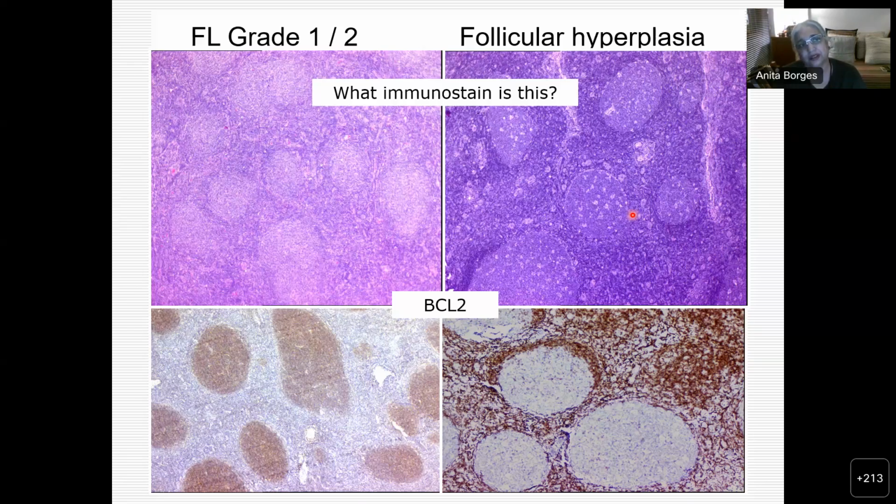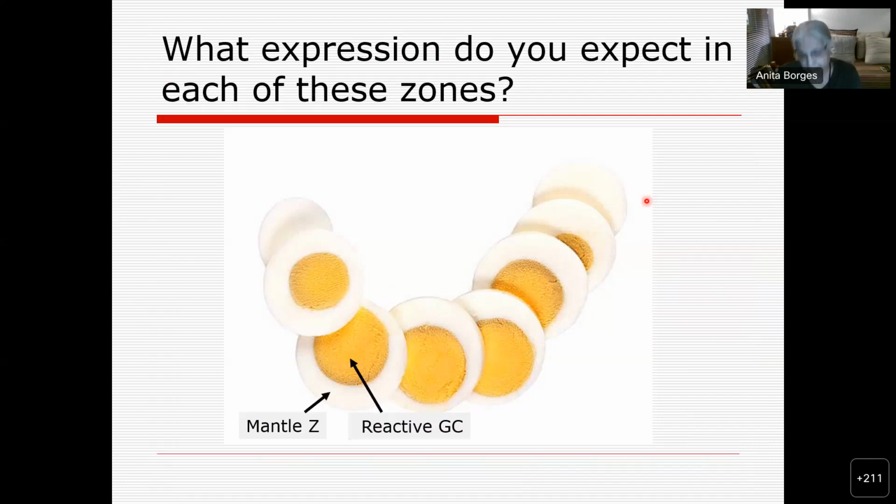When you've got a low-grade follicular lymphoma, and this looks low-grade, I mean, these are not high-grade looking cells, your Ki67 will be low. It is like 10%, 15%. You can never get 10 and 15% in a normal follicle. So that is something that you must remember if you are trying to investigate whether there is a follicular lymphoma or a follicular hyperplasia. Now I'm going to ask you guys, and someone better write it in the chat box.